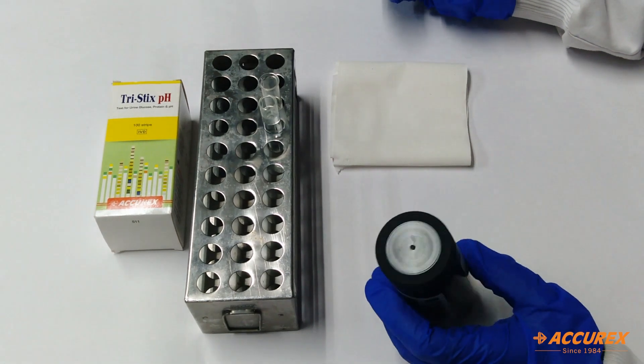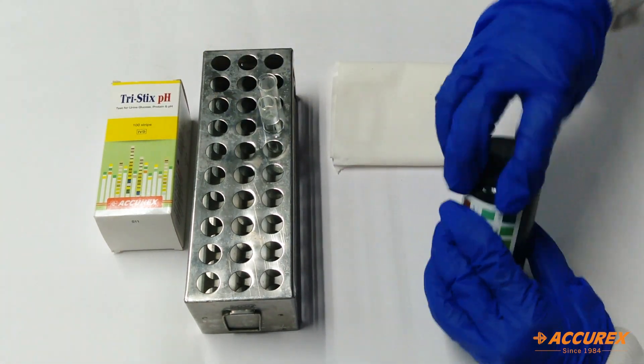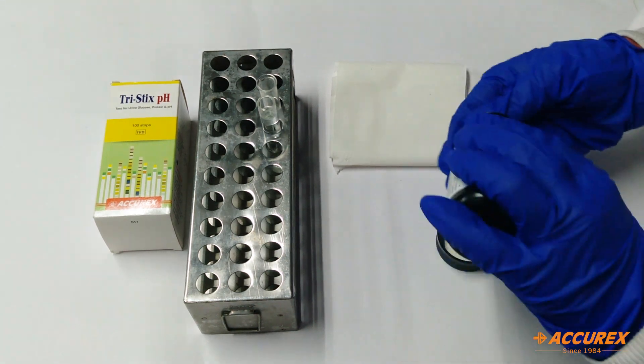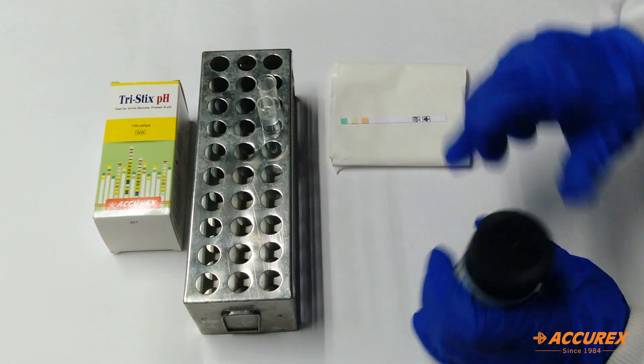For the testing part we need a urine sample, and I have already taken it into the tube. Now take one strip from the bottle and close the bottle immediately to avoid air contamination.